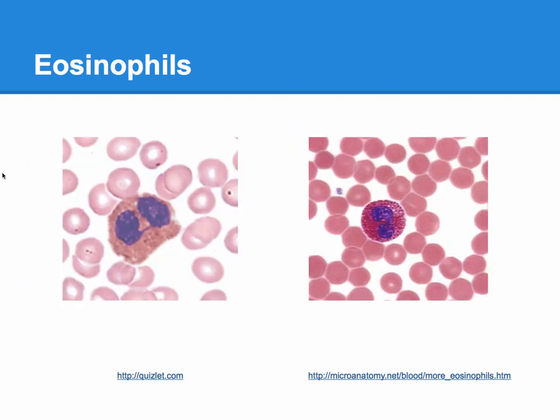Eosinophils have a double-lobed nucleus that appears purple in a Wright-stained smear. The cytoplasmic granules are large and orange in color. You will generally find 1 to 3 eosinophils per 100 leukocytes. Eosinophils secrete toxic materials to kill invaders, phagocytose bacteria, and also secrete chemicals in allergic reactions.